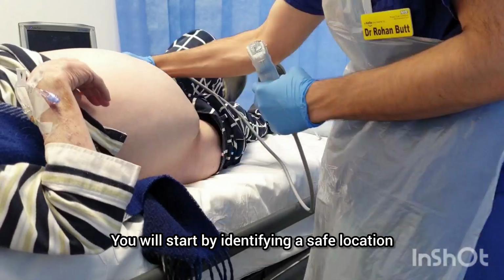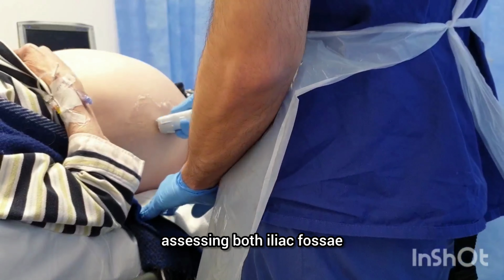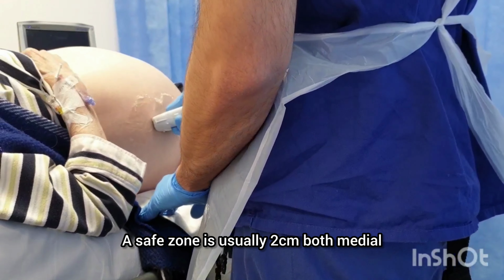You will start by identifying a safe location for insertion using ultrasound, assessing both iliac fossae. A safe zone is usually 2 centimeters both medial and superior from the ASIS. Remember not to wander too medially in order to avoid entanglement with the inferior epigastric arteries. Once identified, you can mark the insertion site with the back of a needle for reference.